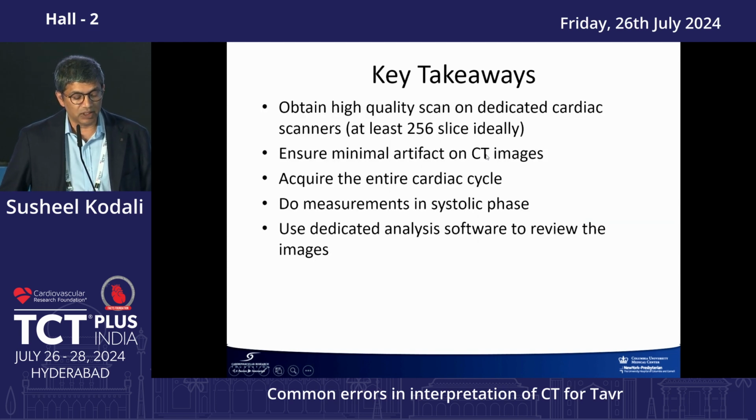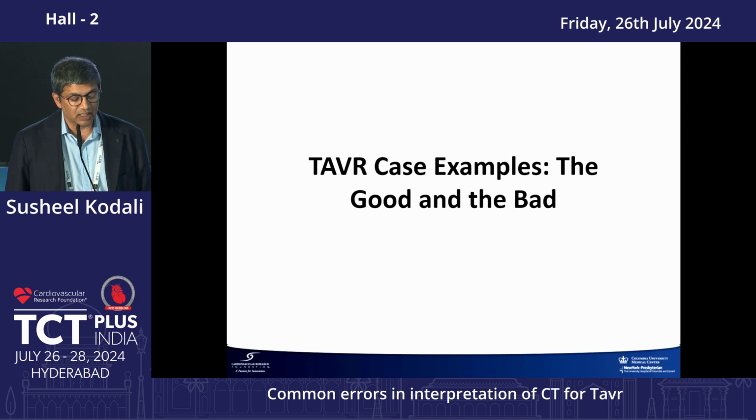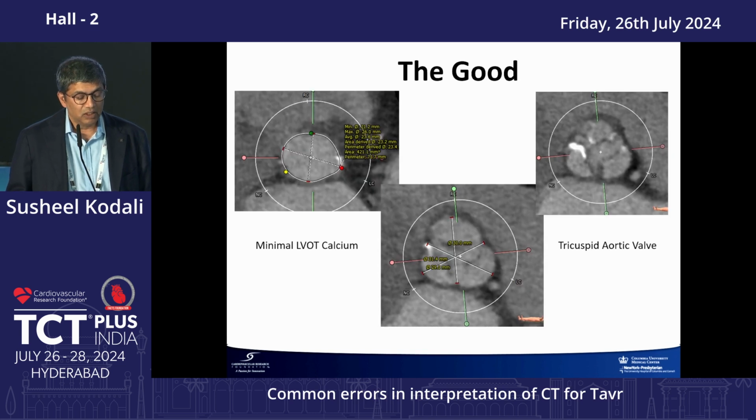So you need a high quality scan. It needs to minimize the artifacts of multiple volume sets. You need to ensure minimal artifact on CTs. You need to get the entire cardiac cycle, do measurements in systolic phase, and use dedicated software. Then you can give a much more informed discussion to the patient.